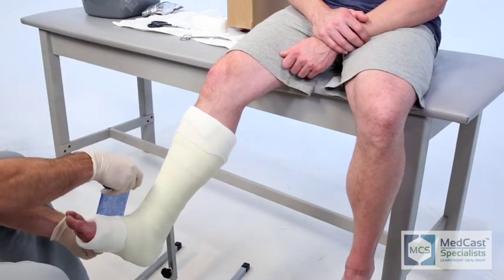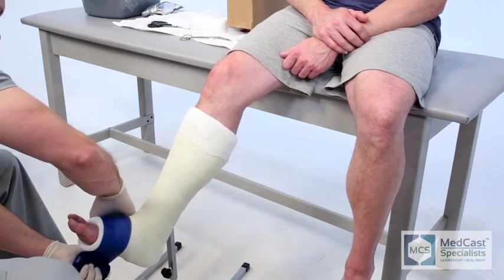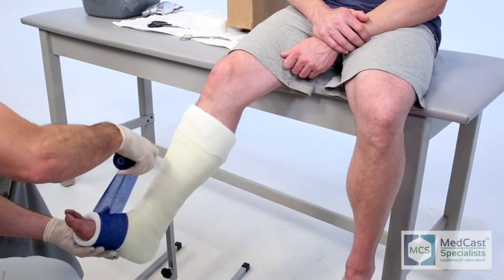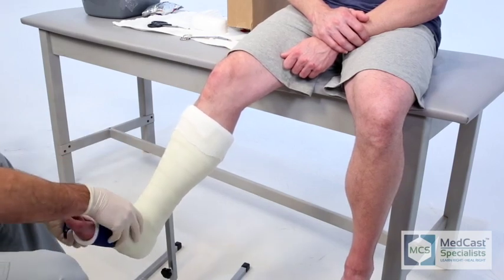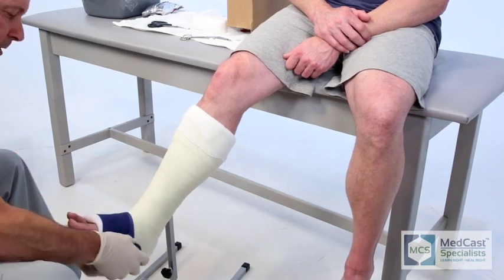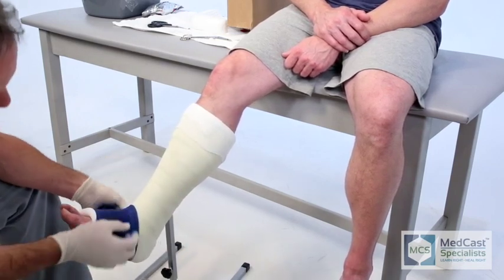As you unroll the first portion of that, always give it a nice good tug. This is also a learning point for new people applying casts — this is the direction you roll. You roll it from the bottom and you don't turn it the other direction or you'll be fighting it too much.